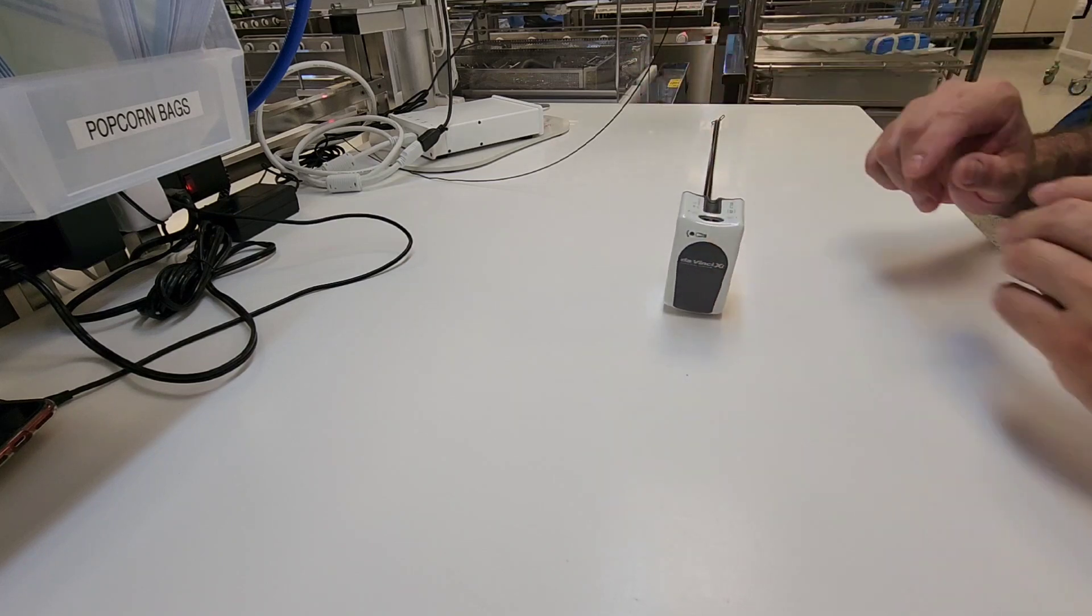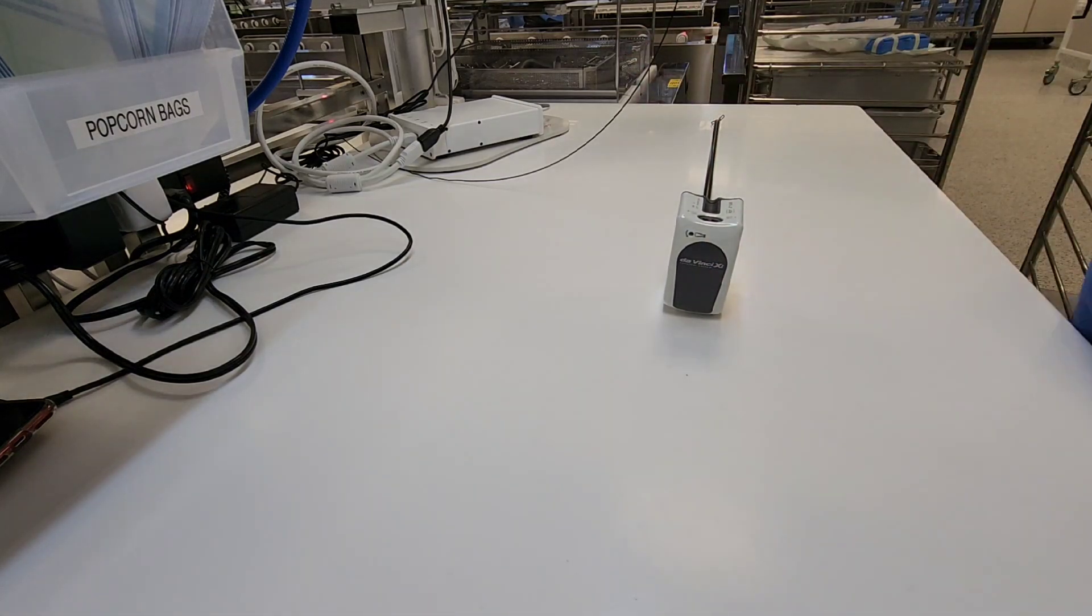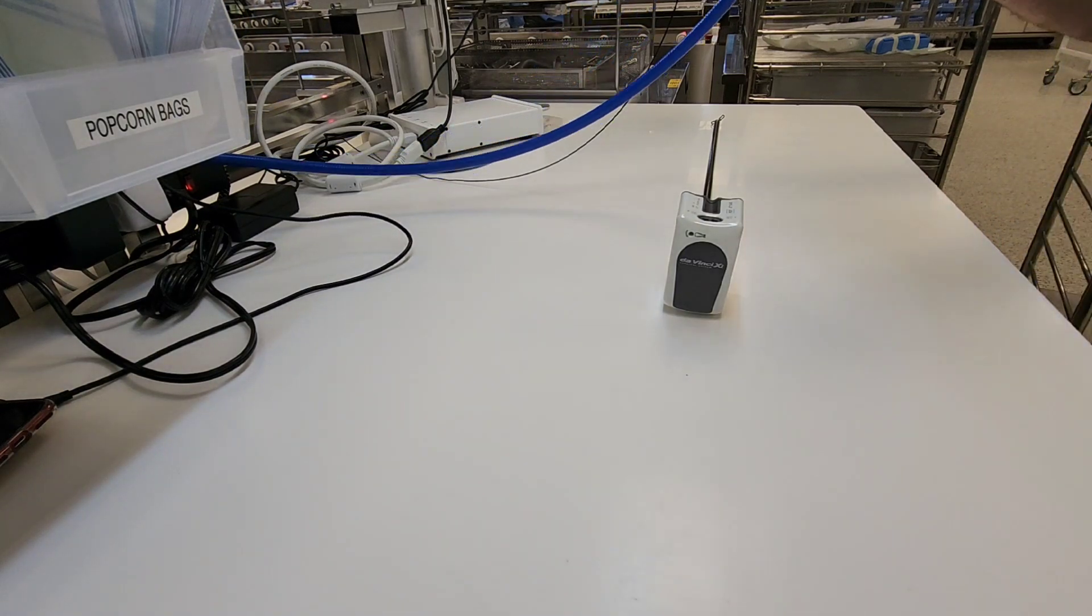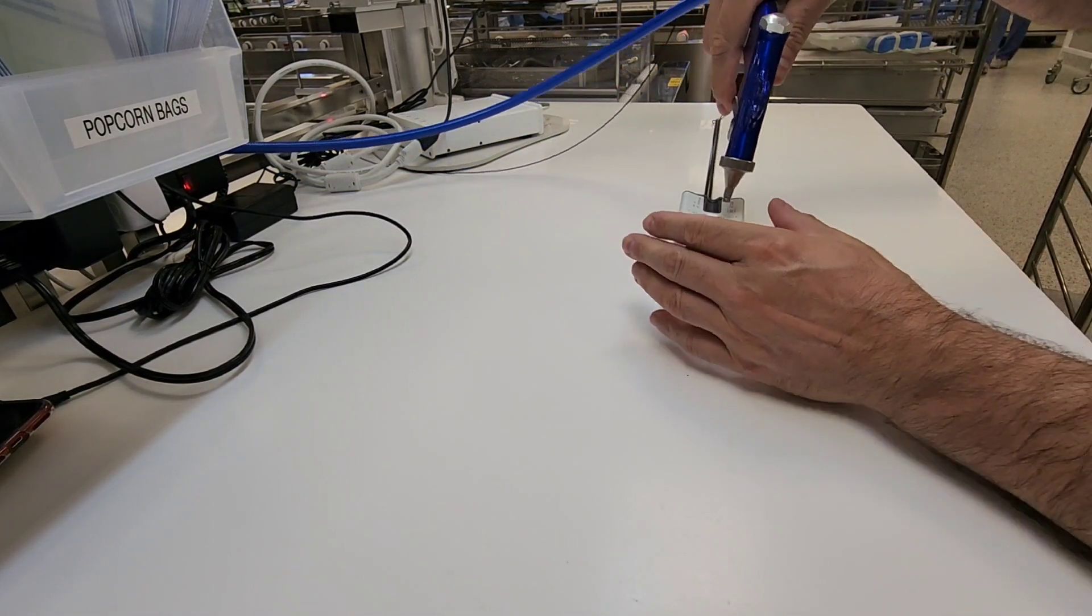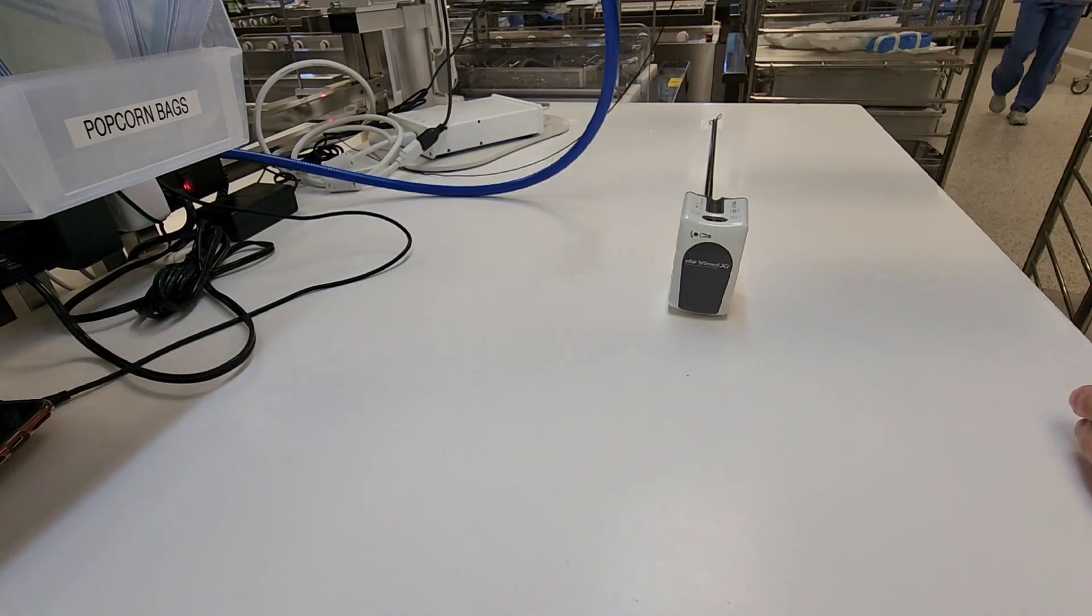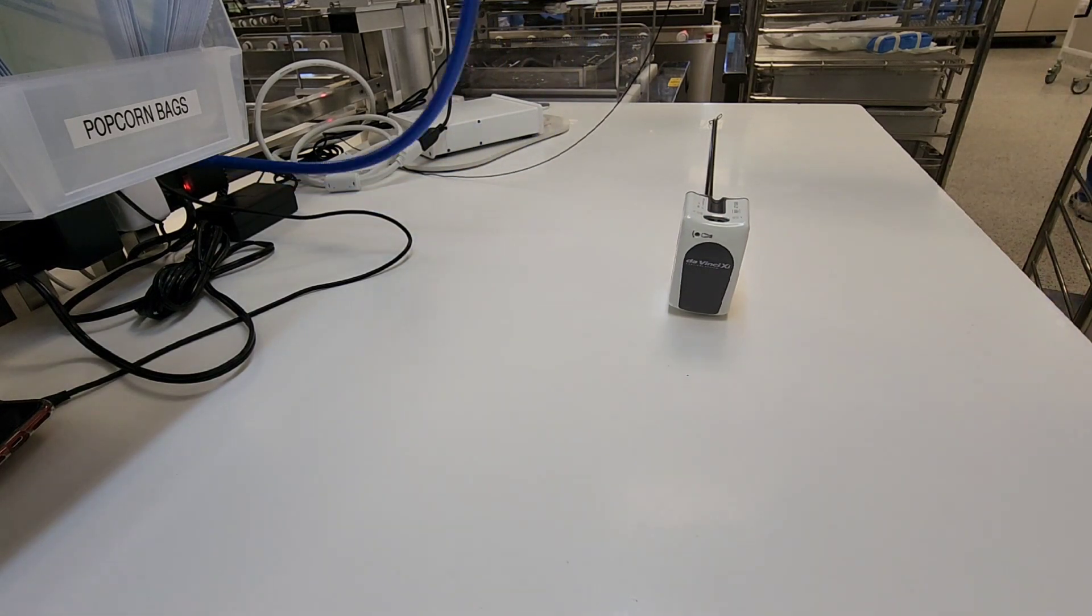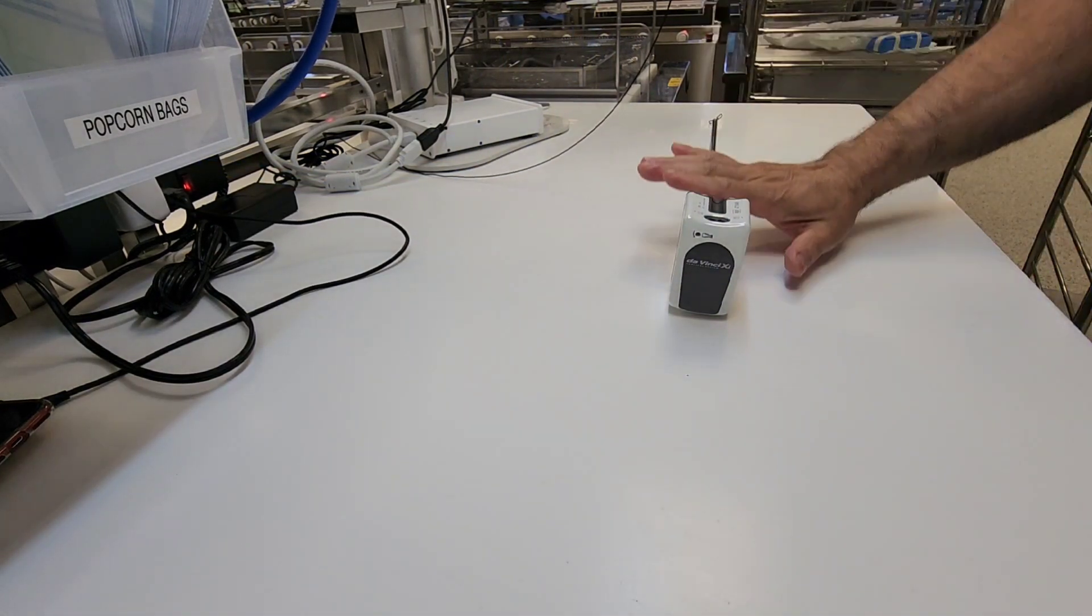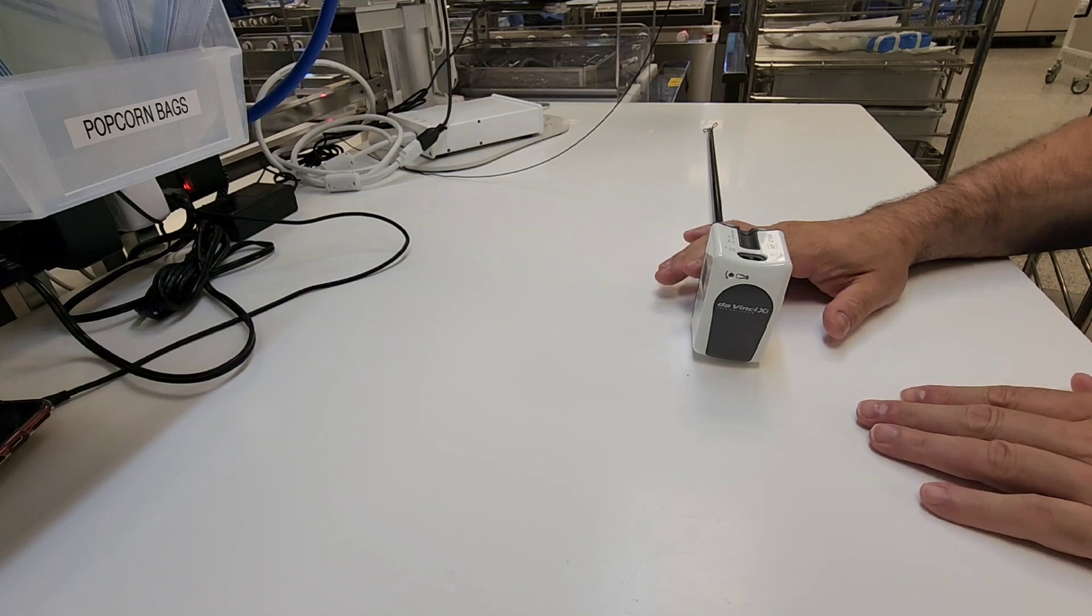We want to inspect for cleanliness and make sure there's no cracks or anything. Now I know the IFU gives you the option to use an air gun to dry the item.